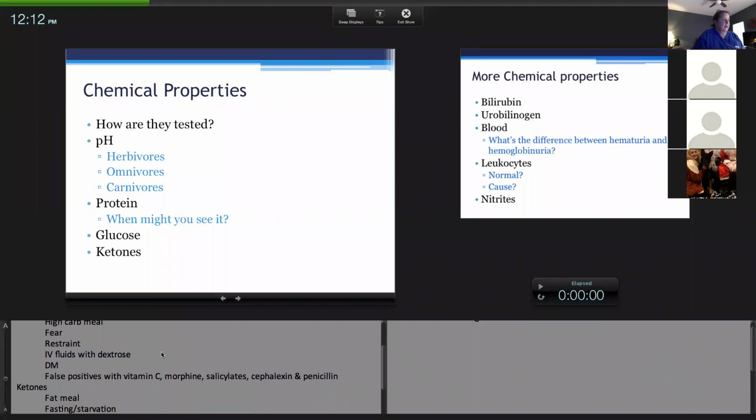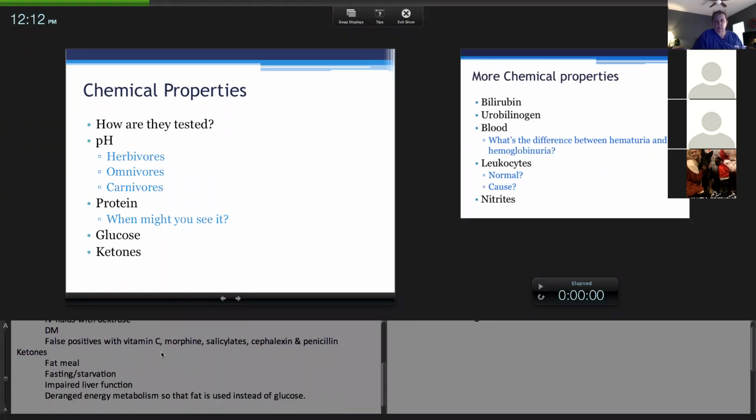And the next thing we check is ketones. Now, ketones is another test that should be negative on a normal urine. But when we do see a positive ketone, we talk about what are things that cause ketosis. Now some of you guys, if you were on that keto diet, people lose weight. Part of it is that the diet is causing you to burn fat and burn stores, and when you break down too much body fat, you can produce ketones. So we do look at what is the fat content in their meal. Are they breaking down too much fat?